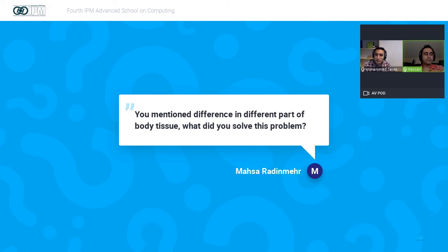One very clear example is if you want to image the brain. You have to go through the skull, and it really aberrates and attenuates the ultrasound. When you work with commercial ultrasound machines, you have to tell the machine what organ you're imaging. Before you start imaging, you have to tell it that you're imaging breast, prostate, or brain. And it changes presettings to optimize the image appearance for that tissue.